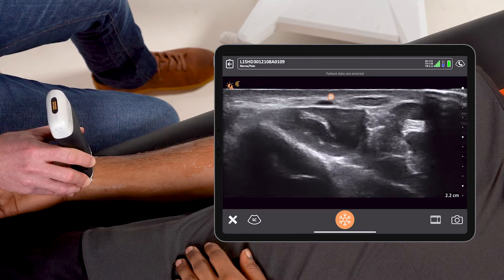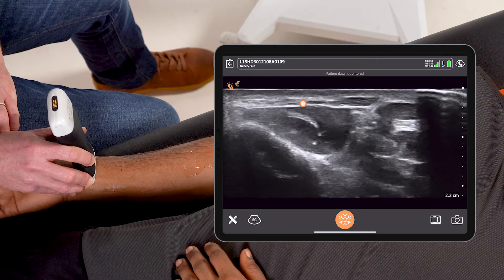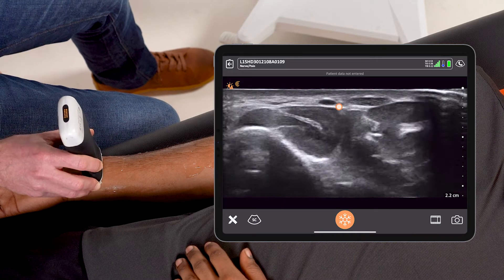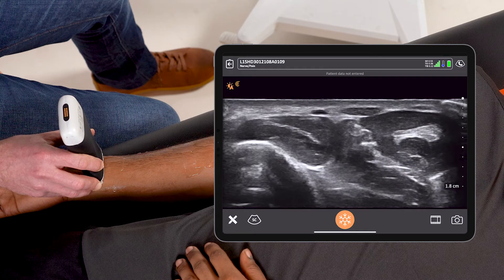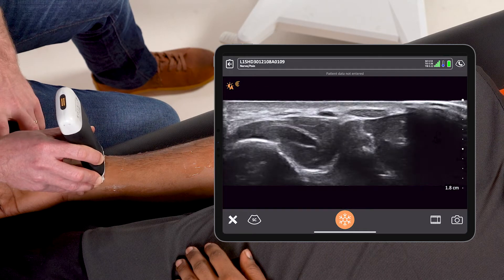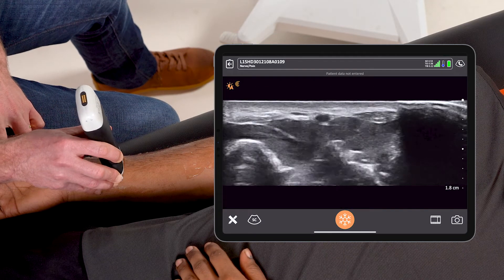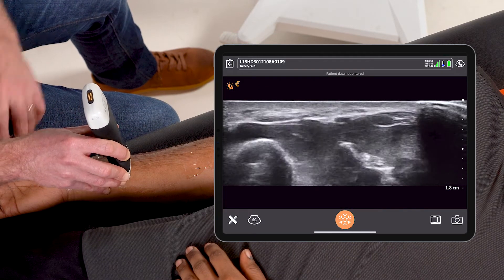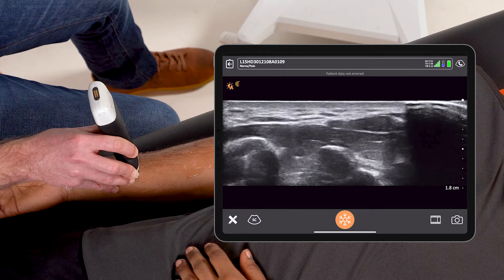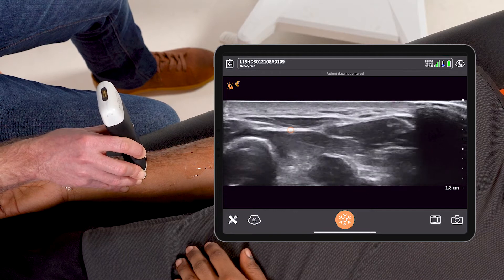First identifying the radial artery. I know that the radial nerve is usually in the radial location to the radial artery, meaning it's going to be here on the lateral aspect.